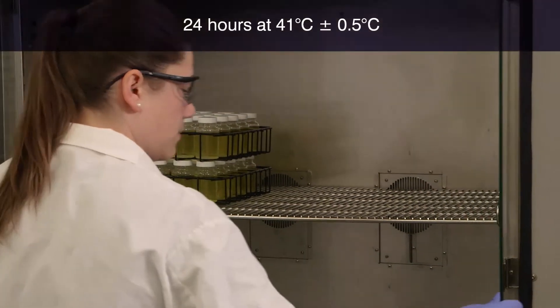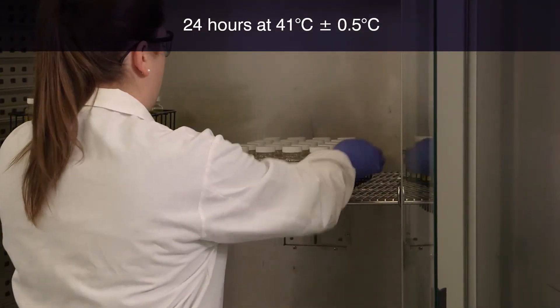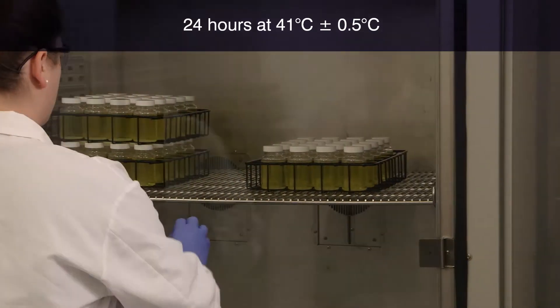Incubate for 24 hours at 41 degrees centigrade, plus or minus 0.5 degrees centigrade, or according to your local regulations.